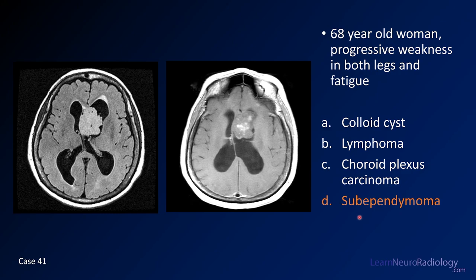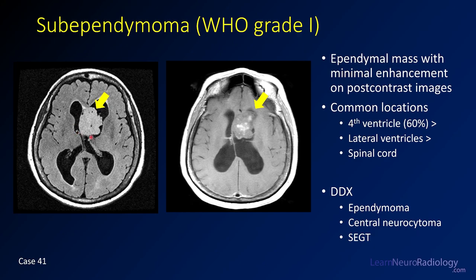This is a case of subependymoma. What you have is an intraventricular mass sitting in the anterior margin of the left lateral ventricle, kind of near the foramen of Monro — a pretty decent place for central neurocytoma. But what you don't have is avid enhancement. When you see an intraventricular mass without much enhancement, you should be thinking about a subependymoma. These are grade one tumors arising from the subependymal margin, and they're not that common.